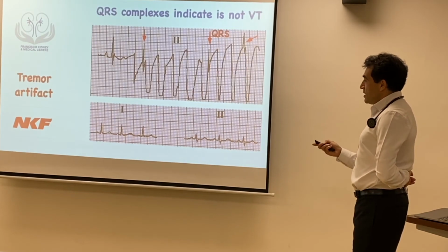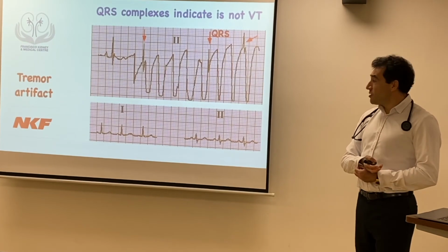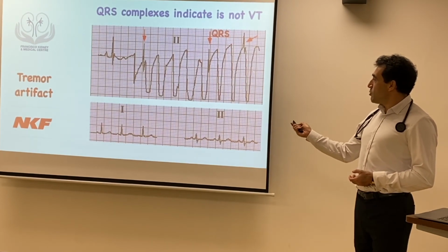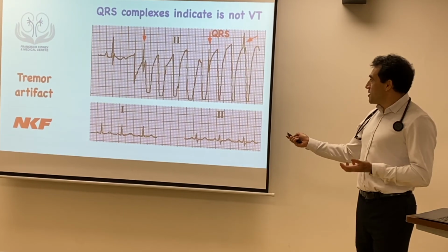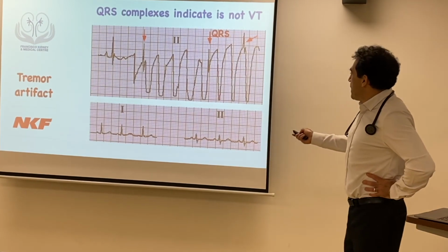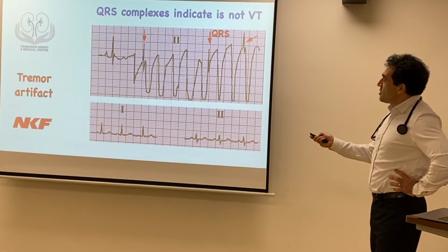Tremor artifact is important, and I think it is very common. Sometimes the patient moves a little bit, and when you know the patient moves, you repeat the ECG. It's very difficult, sometimes you will be worried. What do you think this could be, if it's not tremor? It resembles probably a ventricular fibrillation. If you don't know, you will be worried about ventricular fibrillation. Probably the patient wouldn't be conscious. Or maybe it's a ventricular tachycardia, or whatever. So it's difficult.